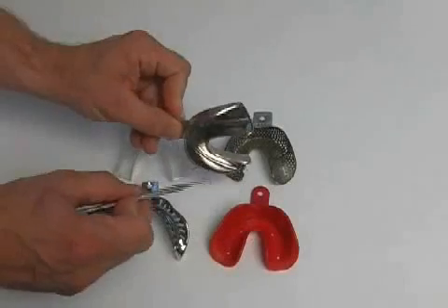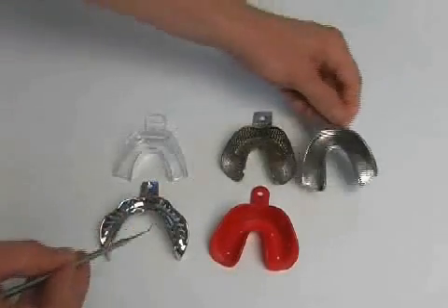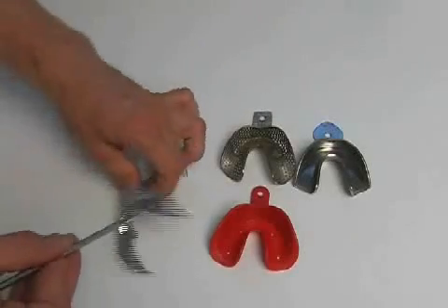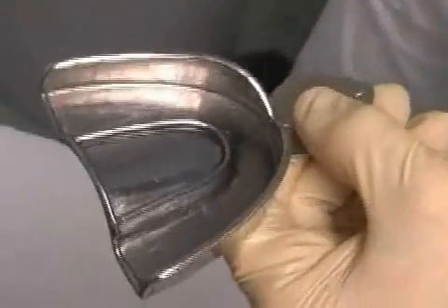The mechanical retentions between the tray and the impression material are achieved through various forms and holes. However, before inserting the impression material, a bonding agent should always be applied as well, in order to prevent the finished impression from detaching from the tray.